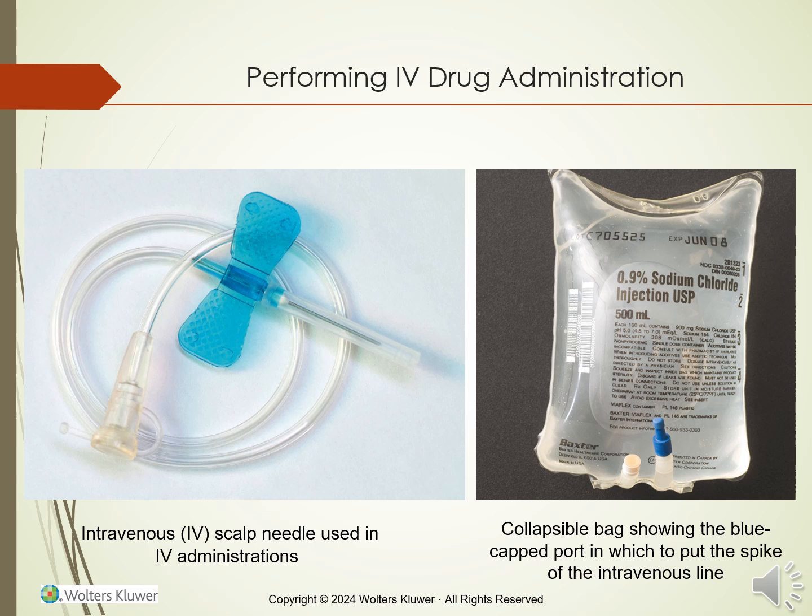You want to gather the necessary items, which include contrast, IV infusion kits, gloves, tape, and a needle or an IV, depending on what you're using. If using an existing IV, you want to draw the contrast into a syringe with a clean, unused needle. You want to prepare IV containers, bags, or glass bottles for tubing attachment if you're doing the larger infusion.